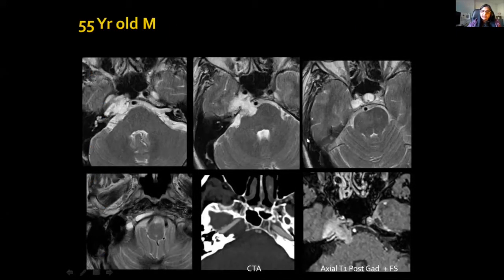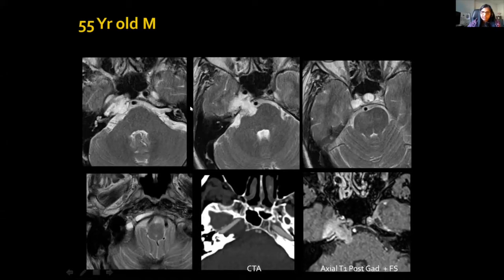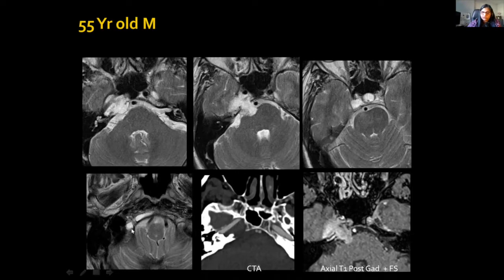To illustrate, another patient with a right-sided chondrosarcoma: the tumour is at both the lateral and medial aspects of the petrous carotid, with a component extending into the prepontine cistern indenting the brain stem, tumour within the cavernous sinus, and tumour extending into the occipital bone on either side of the hypoglossal canal. CT shows erosion of the medial and lateral wall of the petrous canal — all features highly relevant for the surgeon.